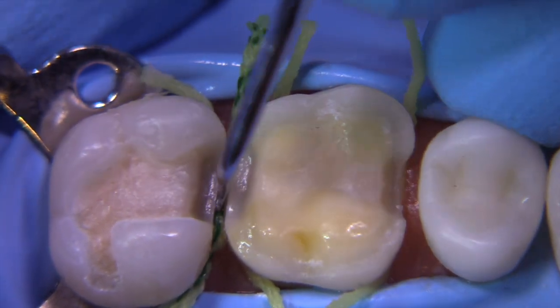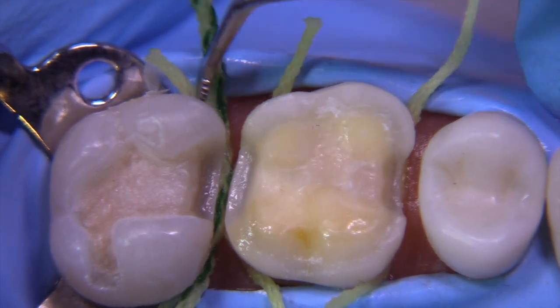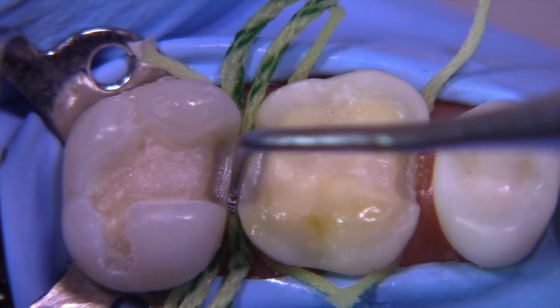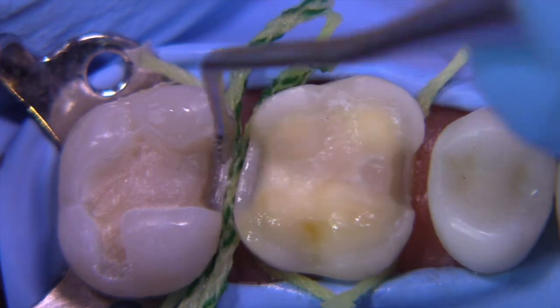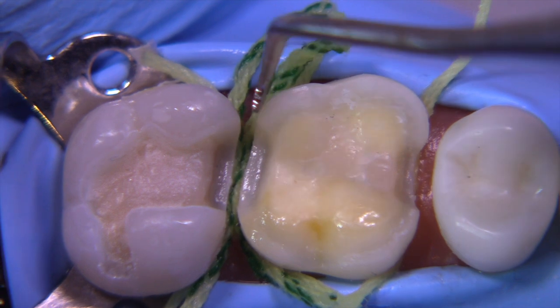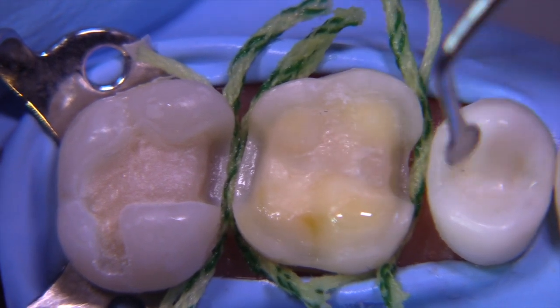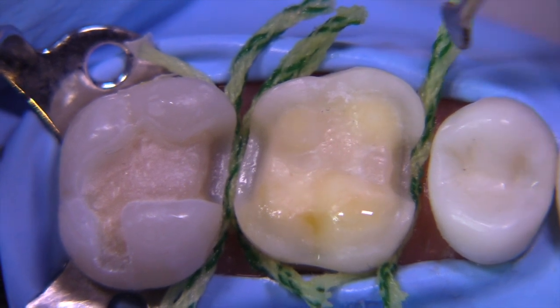The number two cord is now being placed. If the sulcus is so narrow that the number two cord can't fit, a number one cord would suffice. On the other hand, if the sulcus is wide, we can go to a number three cord. Oftentimes the second cord will not fall all the way down to the sulcular area — it will rest up above a little bit, and that's perfectly acceptable. The key is to get that first cord into the sulcus and held down so that when you pull the top cord out at impression-taking, there's no collapse of tissue back over the finish line. If these were supra-gingival finish lines we wouldn't need any cord at all, unless there was tissue seepage. There are also adjuncts like kaolin-containing astringent products like Expasyl or Traxodent, which can be placed on top of the cords to further dry up the tissue.